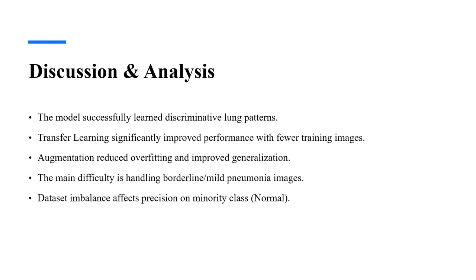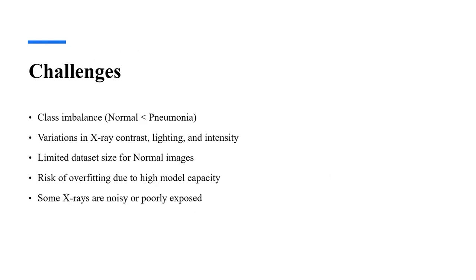Transfer learning helped us achieve high accuracy even with a limited dataset. Data augmentation also improved generalization. The main difficulty was class imbalance, especially because mild pneumonia cases are hard to classify.